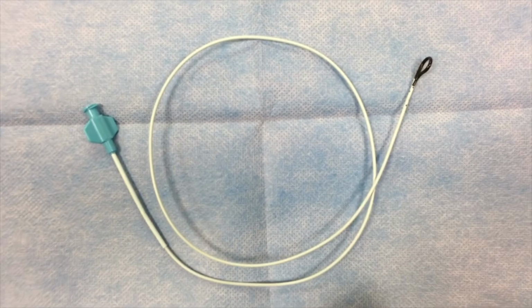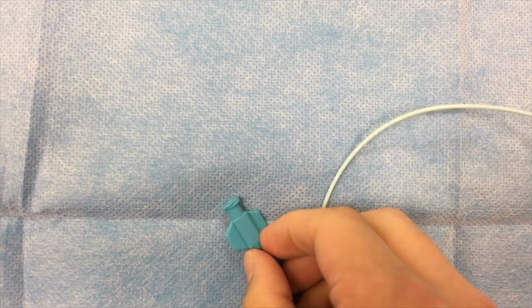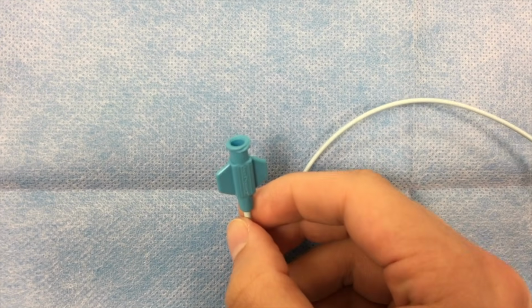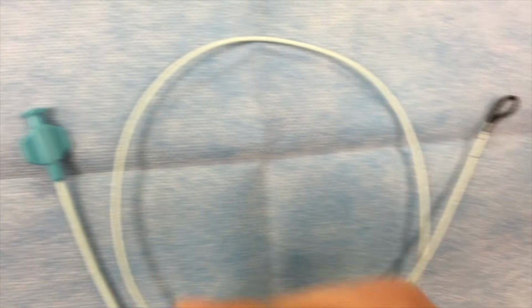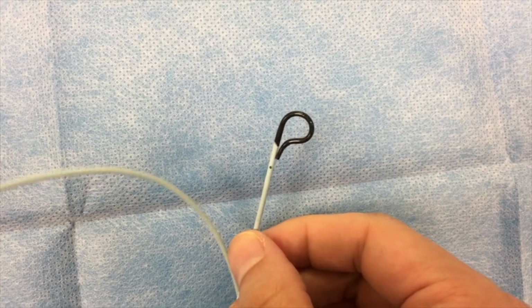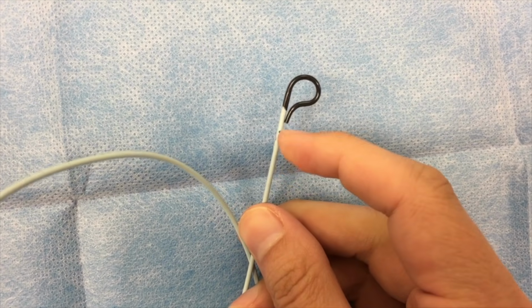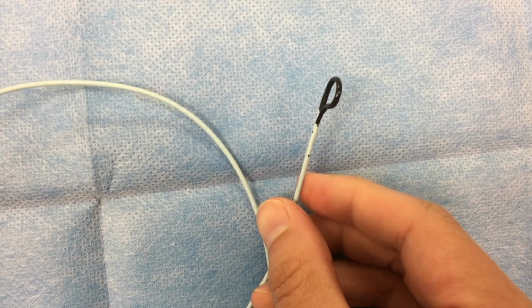So this is an example of an omni-flush catheter. As you can see on this end, this is where you can insert a syringe or connector tubing or whatever you're going to hook this up to. And on this end is the actual end of the catheter. So this is the curve for an omni-flush, and you can see these little side holes are where the contrast will come out when you're injecting.